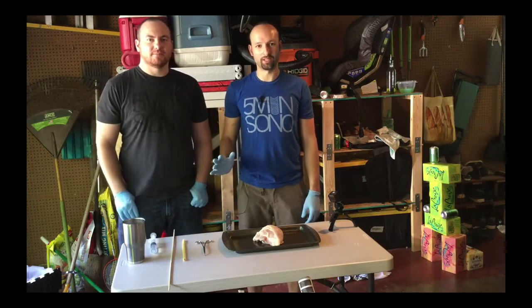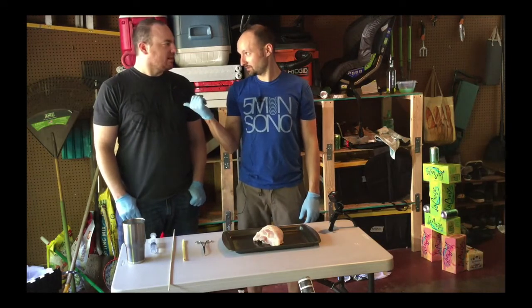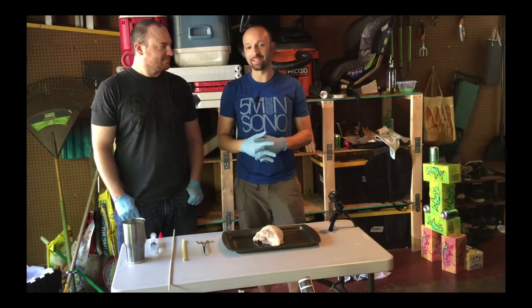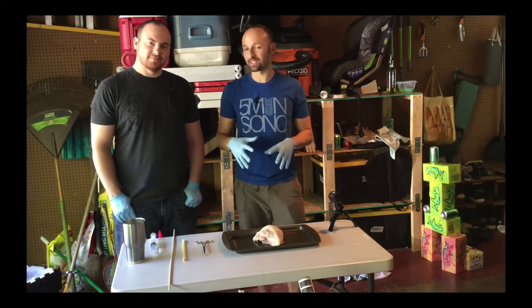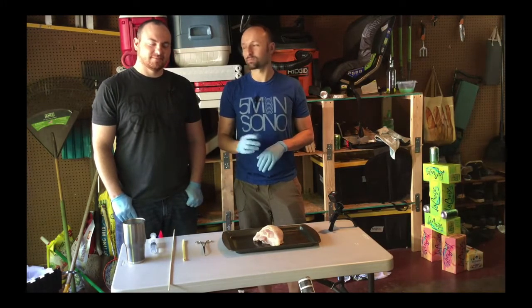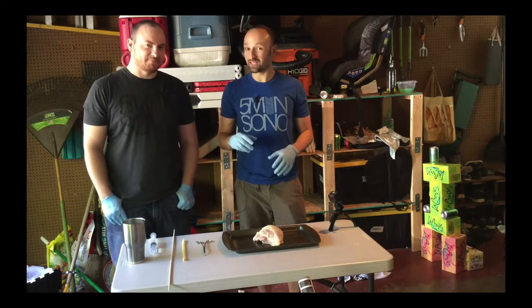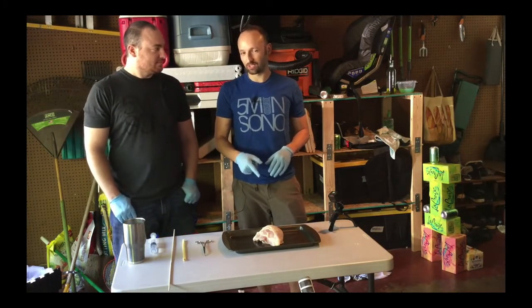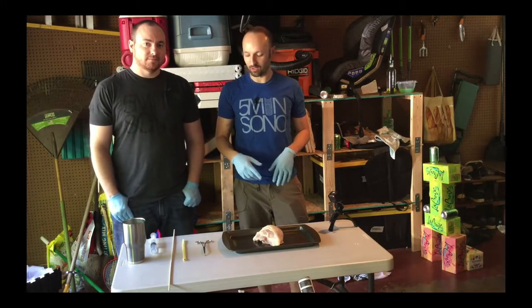Hi, I'm Jason Bowman. Jacob Avila, 5-Minute Sono. EMS Pocus. And we're going to do a Sono Instructables today on another type of vascular access simulator. This one is probably the grosser one that we do, but it actually looks really good. This is using bone-in chicken breasts. You can probably use just regular chicken breasts as well.